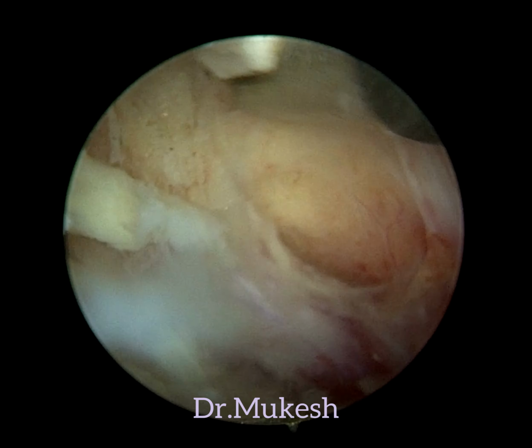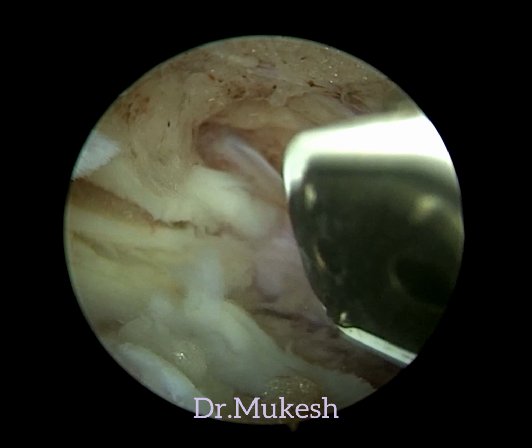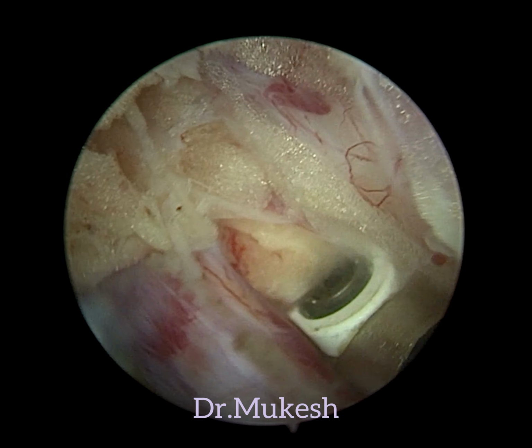So initial steps are same. The only difference is that we don't need to go cranially too much. So just slight drilling of cranial lamina and a lateral drilling of facet joint. Then neural structure we can see, and just by clearing some soft tissue with radio frequency bipolar.